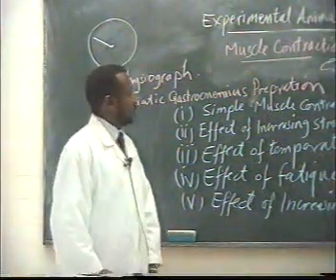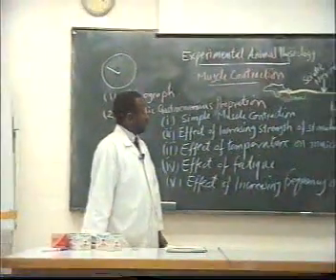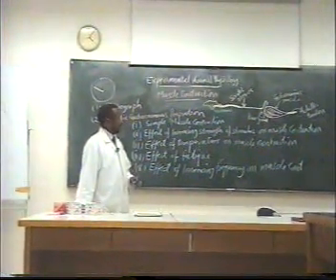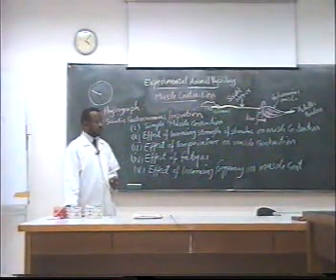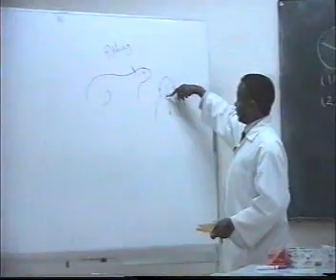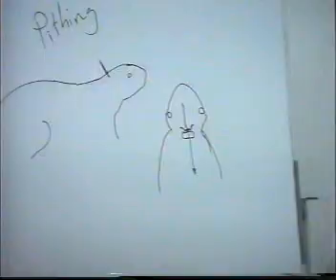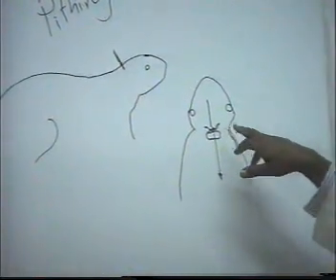For the preparation of the sciatic nerve-gastrocnemius muscle from the frog, we handle the frog and then render it insensible to painful stimuli. So pithing, which is a sort of anesthesia, destroys the nervous system, the brain, medulla oblongata and spinal cord, by insertion of the needle of the seeker.